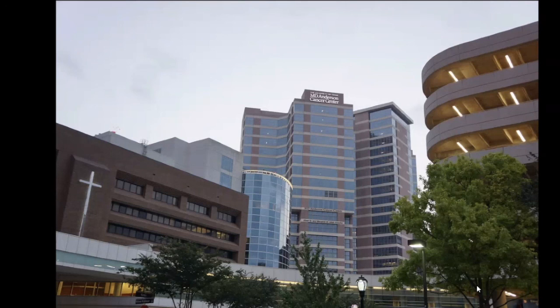Sometimes I don't use a cap. For example, on Friday, I could not use a cap in somebody who had a rectal cancer surgery with a coloanal anastomosis, and I could barely put my index finger through that anastomotic area. So I had to remove the cap to put my scope in, the pediatric scope. So I feel a little bit uncomfortable to scope without the cap. So in that case, I actually did retroflexion. So there are cases where you could do it.